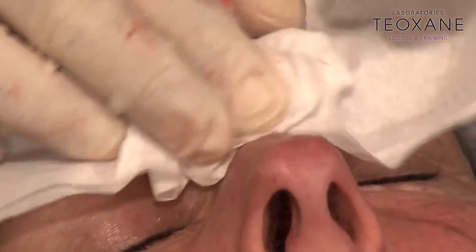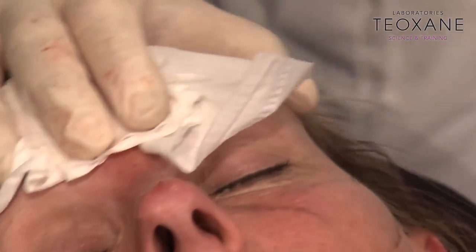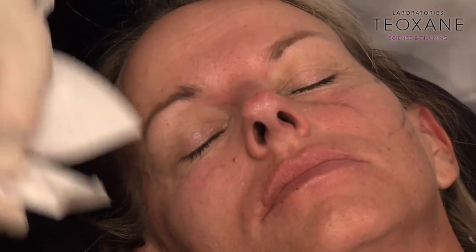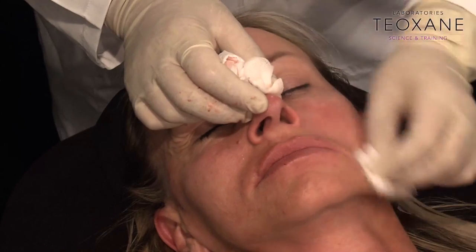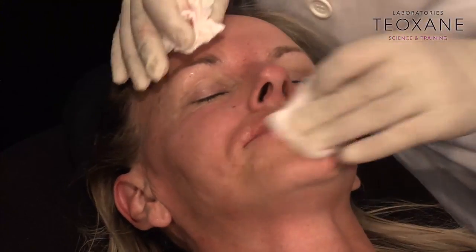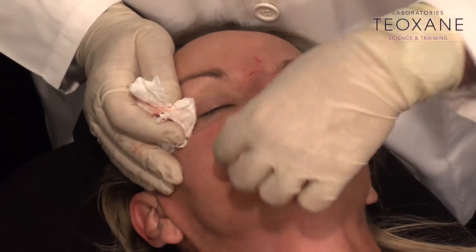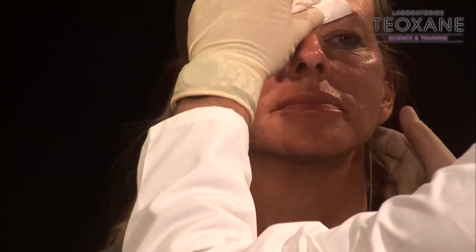So I've done some nose reshaping, as we could call that. It's quite interesting, in fact, because as you can see, the alar cartilage are less prominent. The tip is softer, rounder, which is in a way less aggressive, maybe, for the eyes. We have no bruise. That's very important. You're doing cosmetic medical treatments. You're not doing surgery. Patients should not be bruised. They should be in and out. No downtime. They hate downtime. Nobody wants downtime.